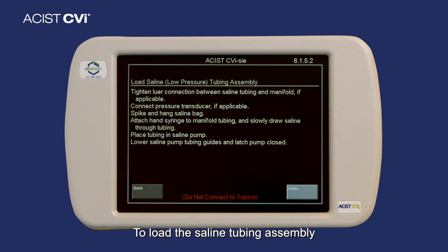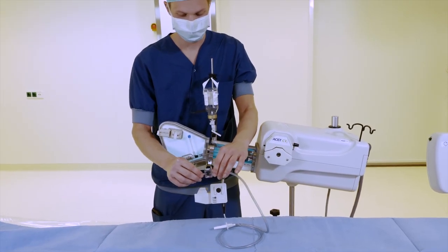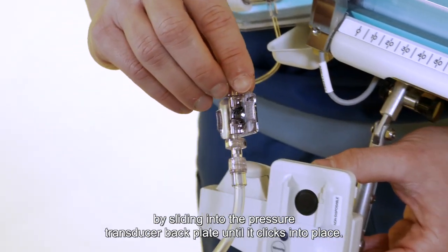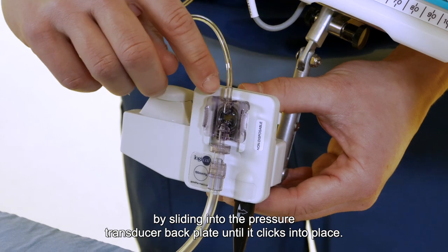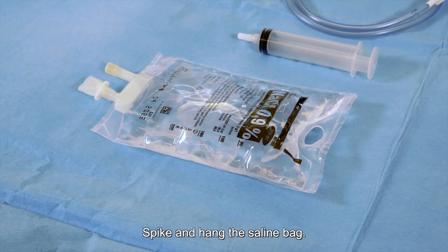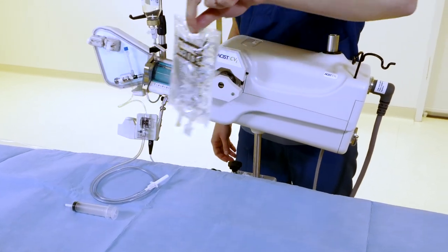To load the saline tubing assembly, follow these steps. Step 1. Remove the protective cover from the pressure transducer cartridge and insert it by sliding it into the pressure transducer backplate until it clicks into place. Step 2. Spike and hang the saline bag.